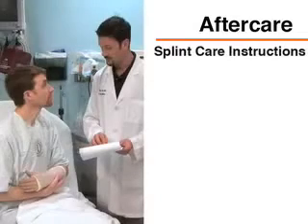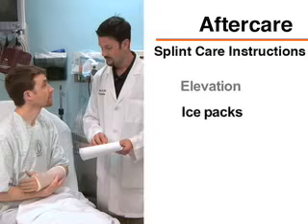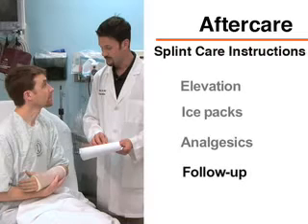Typical care after the application of a splint should include extremity elevation, application of ice packs, administration of analgesics, and appropriate communication of instructions for medical follow-up. Instruct the patient to keep the splint clean and dry and not to remove it until instructed.